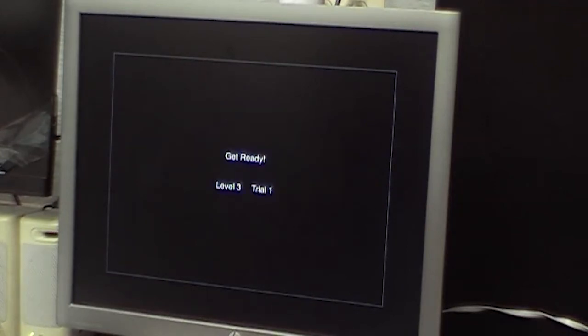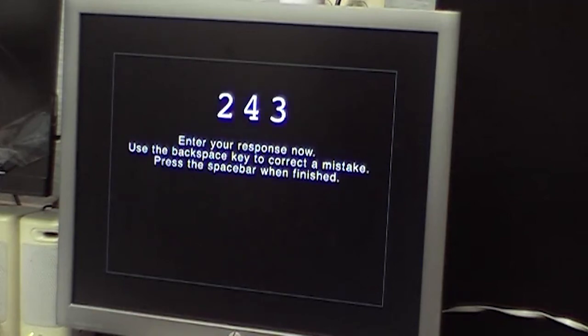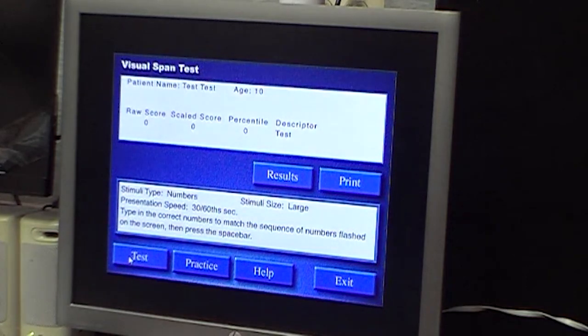Why is that important? The reason that's important is because we're not only looking at a word, we have to connect the word that we're reading to the word prior to that, to the phrase prior to that, to the prior sentence, to the prior paragraph, to the prior page, and we have to put that in a sequence. Otherwise, we don't really understand what the author is writing to us. This test is also normed, so we compare an individual relative to thousands of other people of that age that are already in that database.